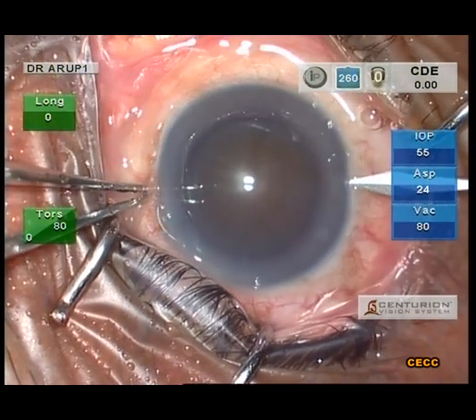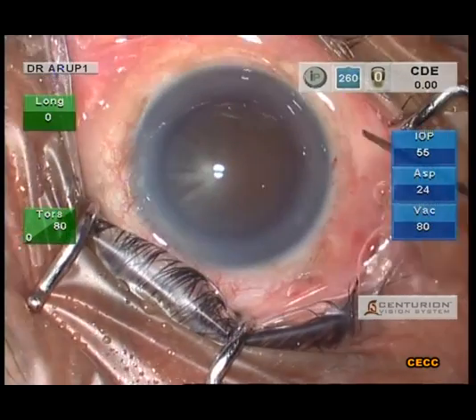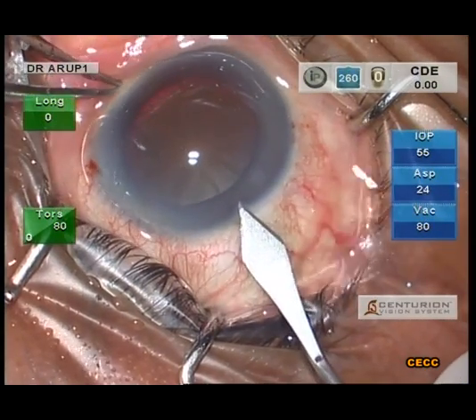This video demonstrates an effective method of dealing with a hard cataract, highlighting the chopping principles. This is a grade 4 cataract.